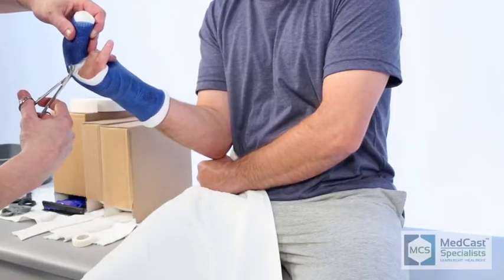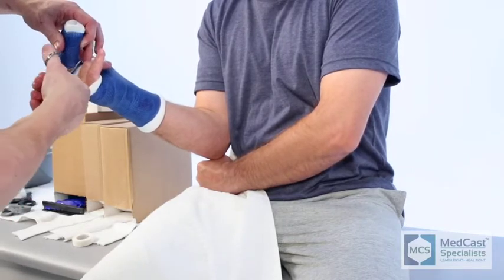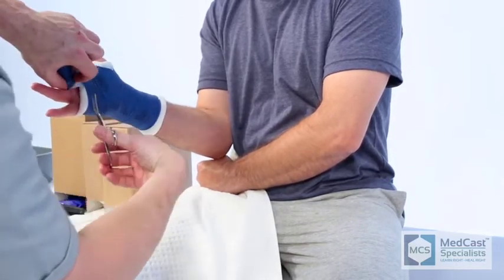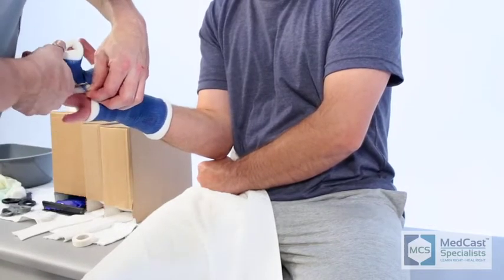If you happen to get your cast material down into the web space between the fingers, you can use scissors or the cast saw. The scissors are much easier. You always want your patient to be comfortable and have as much range of motion in the digits that are left out of the cast. So cutting out any excess bulk there makes it much easier for the patient.